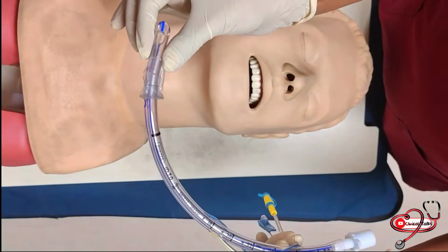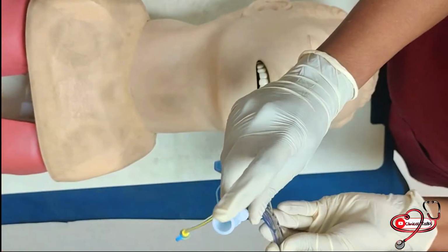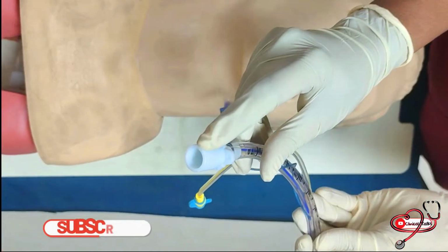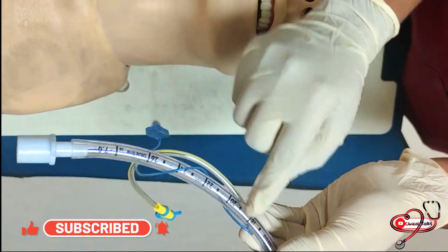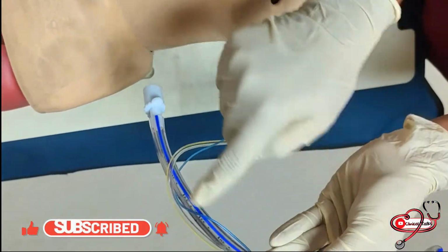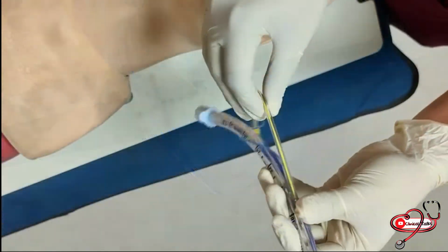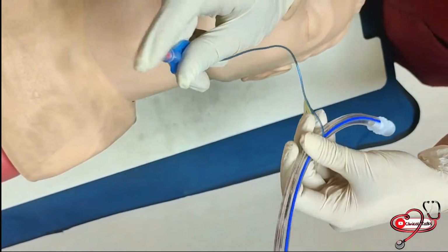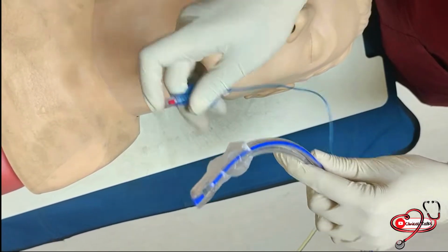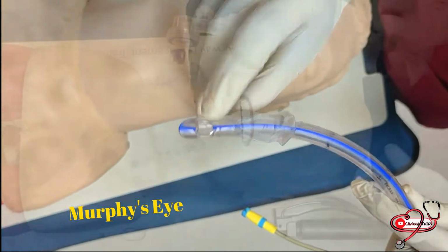So this is a number 7 endotracheal tube. This is the universal adapter, and here you can see there are markings. These are depth markings, and there is one blue line over the endotracheal tube that is called the radio-opaque line. This is a subglottic suction inflating tube with a one-way valve. This is the tip of the endotracheal tube, and this is called Murphy's eye.